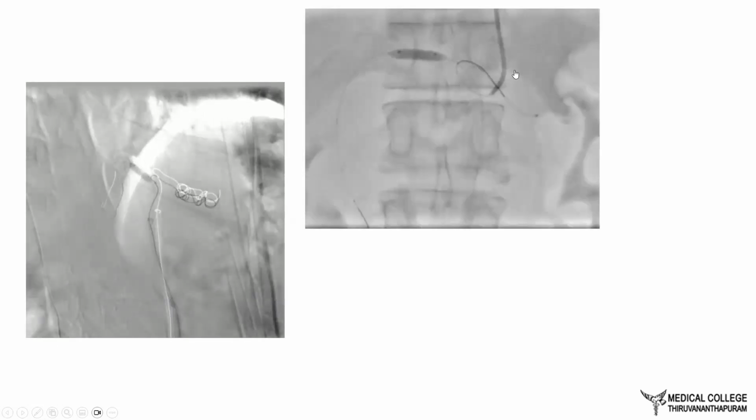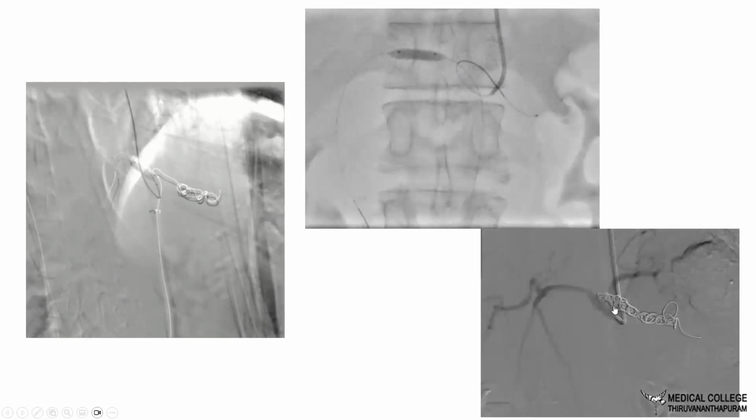So then we changed to coiling from the radial side. This was a radial vertebral guide that we had placed, with the microcatheter into the splenic artery. The balloon was kept inflated and then coiling was done from the radial. So this is an example of coronary balloon assisted coiling.